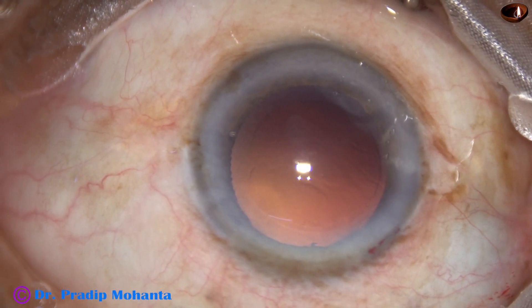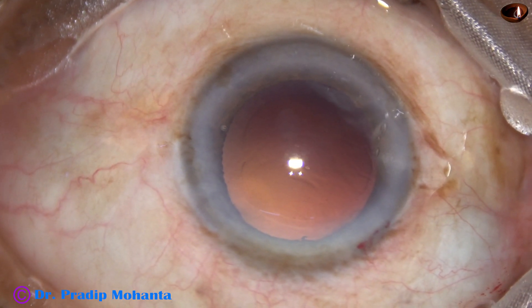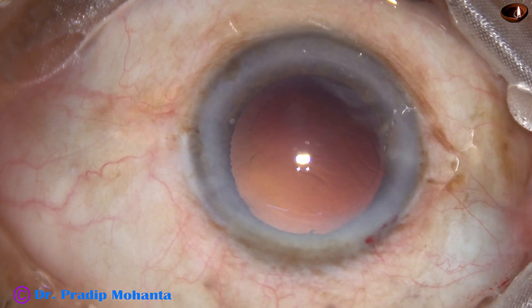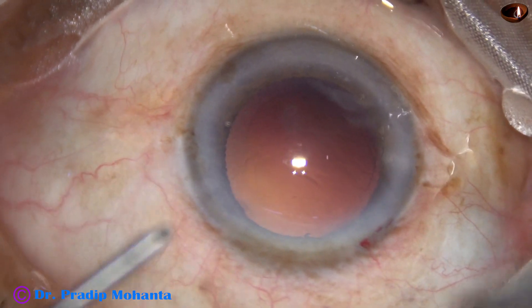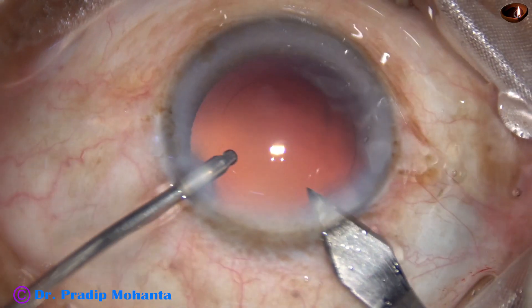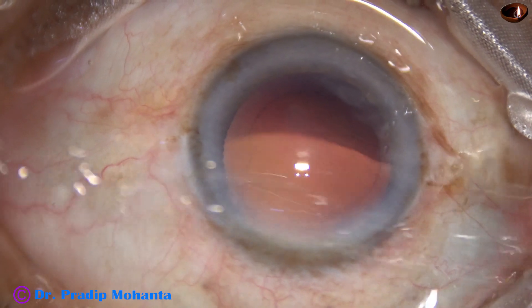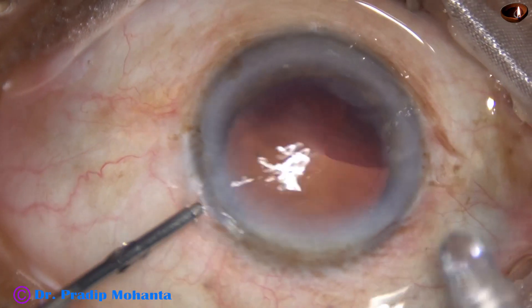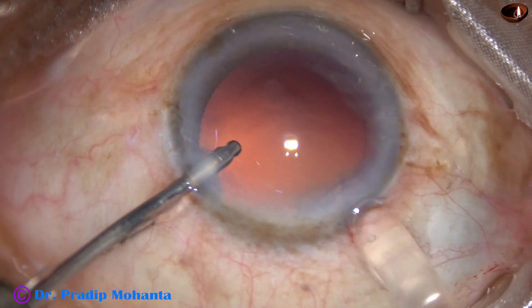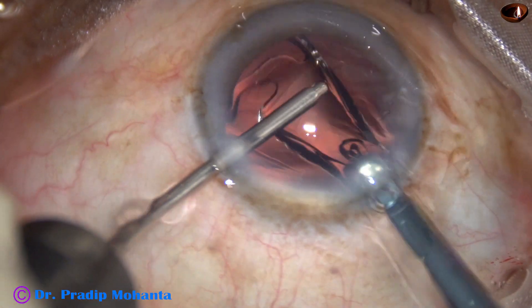The cortex has been nicely cleaned and now is the time to implant an intraocular lens. I am going to use a B-cartridge, so I enlarge the main wound a little bit — the size of the main wound becomes about 3 mm. Now this is hydro-implantation of a single-piece monofocal intraocular lens.